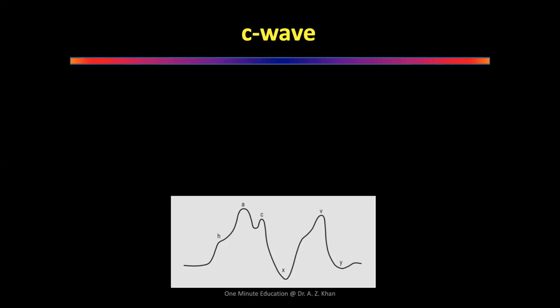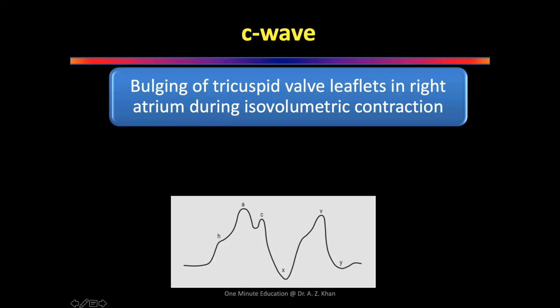More than closure, what does it represent? Bulging of the valve. Absolutely right. It's the bulging of the tricuspid valve into the right atrium. Okay, that's what it represents.